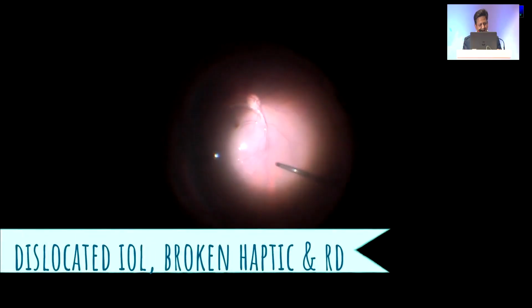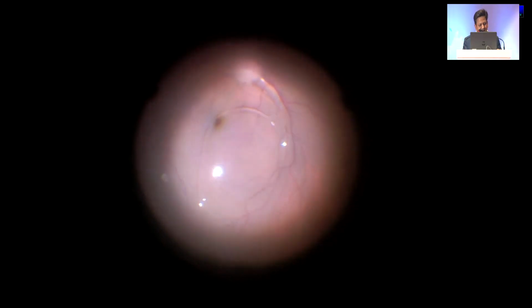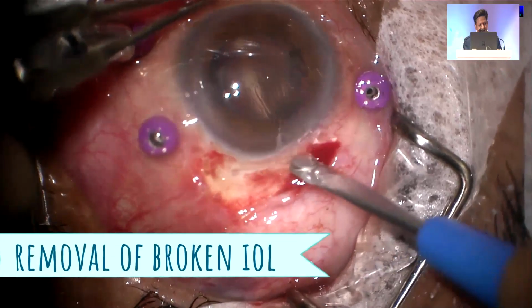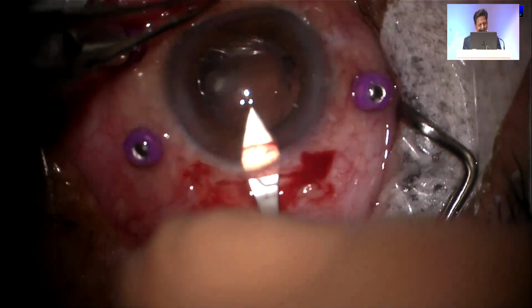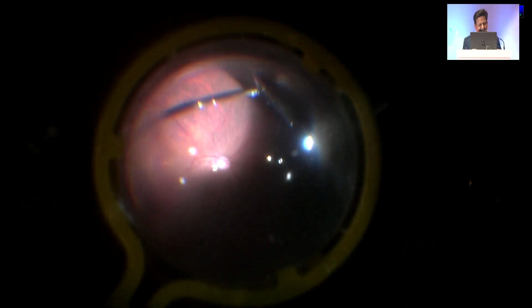And this is another IOL. Sometimes these IOLs, you can't fixate them. You see one of the haptics is broken in this IOL. This IOL needs to be removed. So what you can do is put PFCL to stabilize the retina, and then make a corneoscleral tunnel, bring out the lens and put in another lens, and then proceed with the cataract surgery. Then proceed with the retinal detachment surgery.